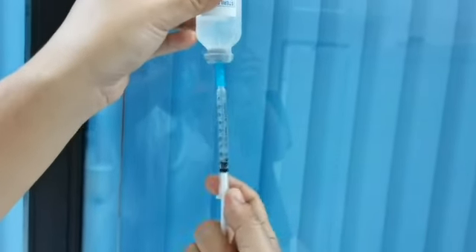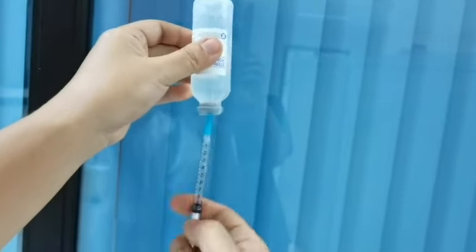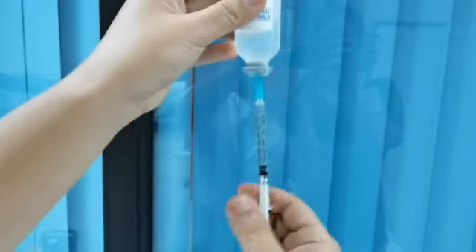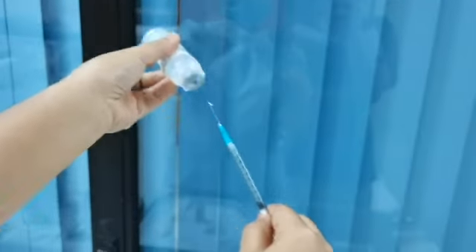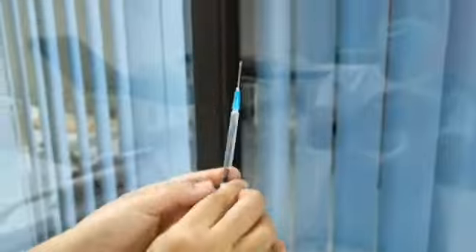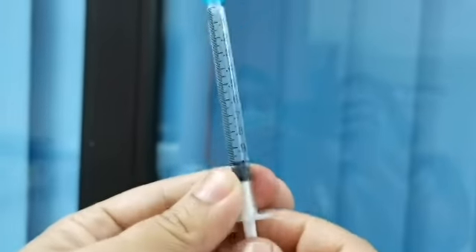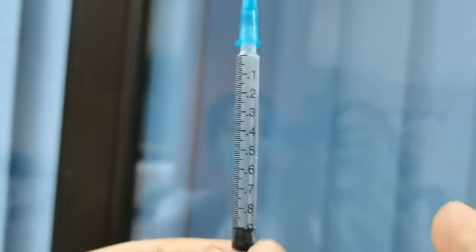So there are bubbles, so you can tap with your fingers, or you can move this plunger up and down to get rid of the air. So remove, then you expel the air inside the syringe by doing like this or by moving the plunger. So it's 0.9 and there's no air on it.